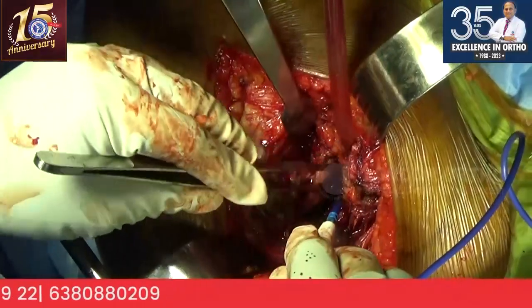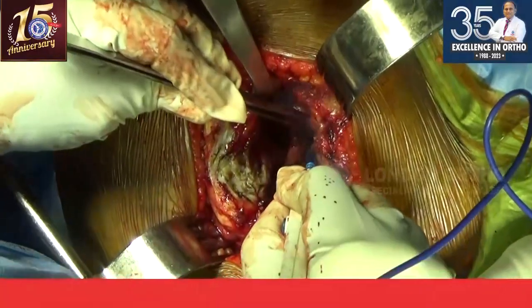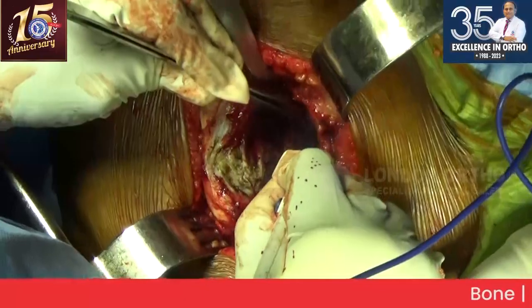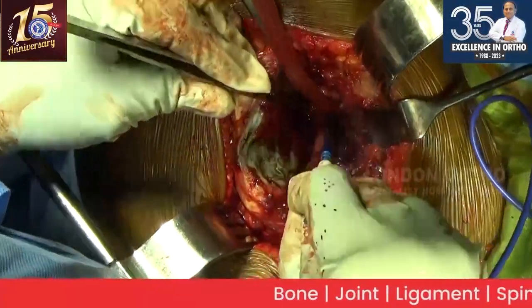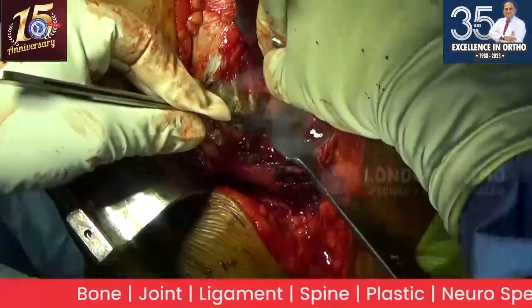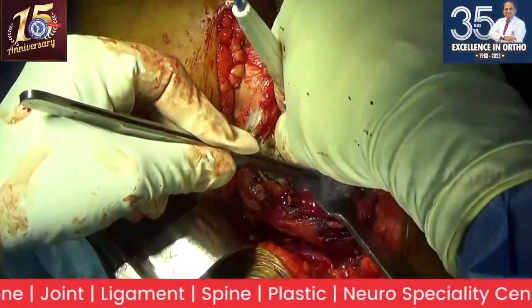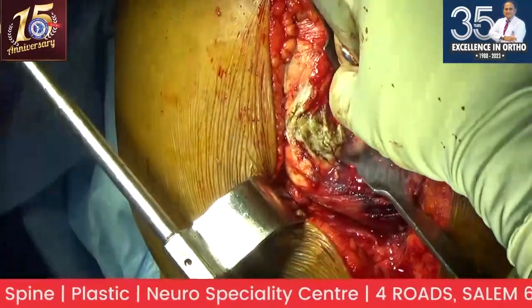Capsule, you don't need to repair. When you close it, it will fall into its place nicely, so you don't need to separately repair it. So in this particular case, I am doing this release, which Dr. Singarevel was asking me about, what I'm going to do more for this case.